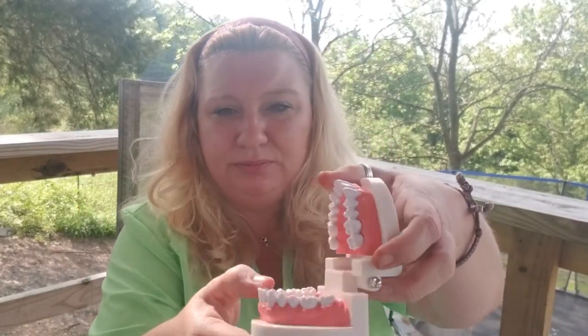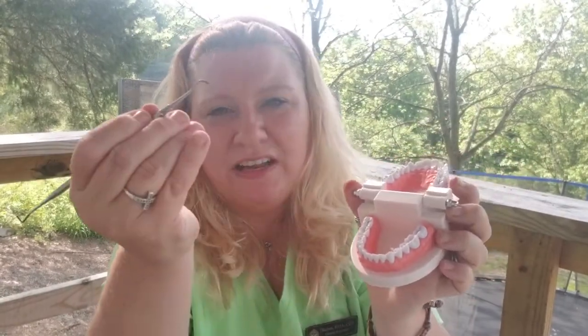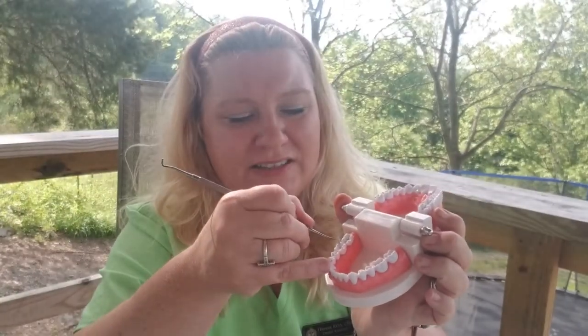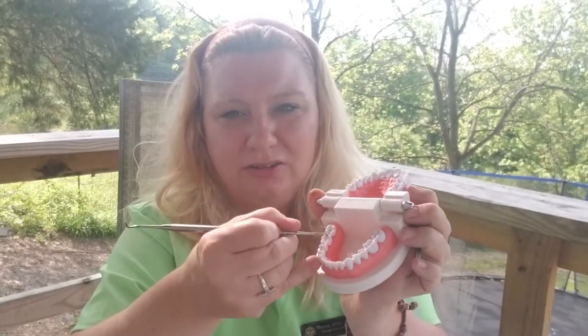If you're ever asked to place a temporary filling, don't panic. Take the cotton pellet, stick it inside the tooth, then put the material inside, pushing down. You can use your Woodson instrument — put it down inside the canal and pack it. Let the patient know they have a temporary filling and that it could come out, and that they need to come back to have it replaced. It's very important because bacteria can get back inside those canals.